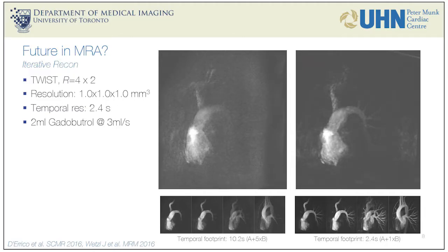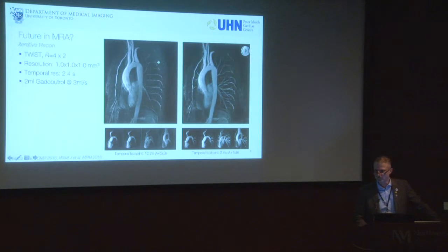So moving on, just showing you something that may happen, and we have seen the nice talk about acceleration in imaging this morning. There's major efforts going on to further improve dynamic imaging and also static compressed sensing MR angiography. This actually just shows you identical raw data on the left versus the right.